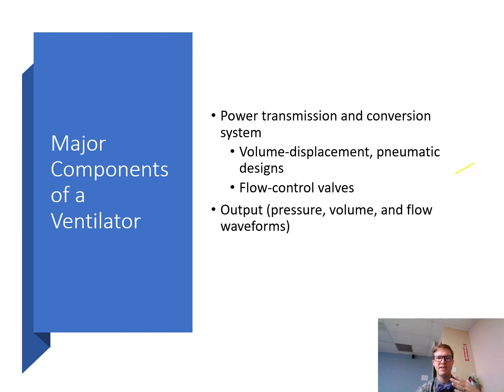Solenoids can be controlled in 3 ways: by electrical timers or microprocessors, by manual operation, and by pressure. Those are your 3 things that can control solenoids. Electrical timers and microprocessors have electrical currents that pass through the magnets that open the valves, what we just talked about.